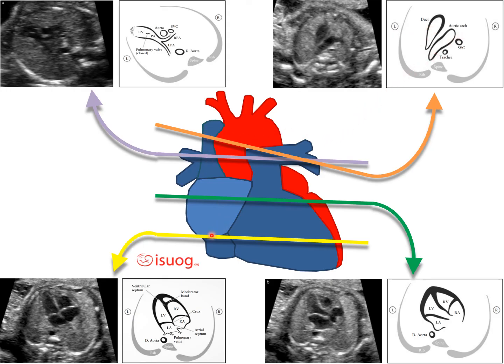These are all at different levels in the fetal thorax, and rather than just tipping the probe cephalad in the fetus, you'd want to make these slight sweeps, slight movement of the transducer toward the upper part of the chest, toward the more cephalad in the fetus, to get these different views of these structures. So critically important.